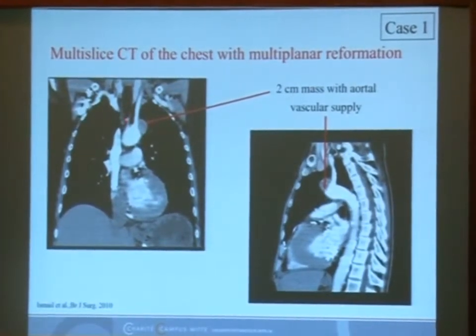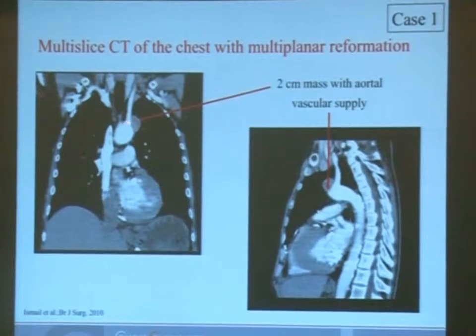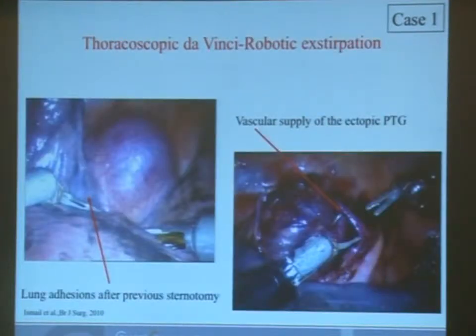And look, this was the CAT scan analysis, maybe you see it here, with a direct vascular supply from the aortic arch and positioned a little bit between the supra-aortic arteries. And these pictures now look a little bit easier. There were adhesions of the lung to be taken away, and then we saw this picture at the aortic arch, and you may imagine, this is one of the points with that topic, that with only straight instruments, it would have been by far not as good, not as easy to dissect directly in that area.